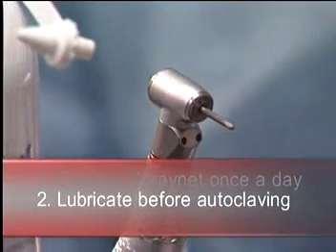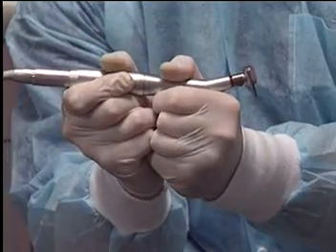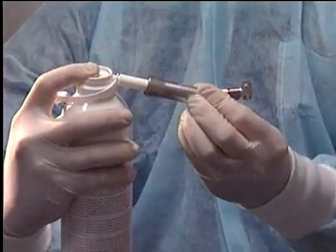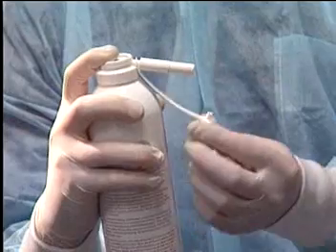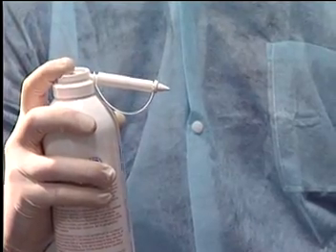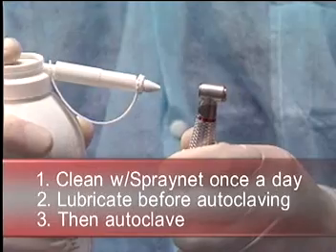To lubricate, repeat the procedure using Lubrifluid 500. Remove the motor again and remove the burr. Holding the Lubrifluid can in an upright position, place one short spray into the end of the handpiece. Use the attached nozzle to lubricate the other end. Lubricate prior to sterilization.